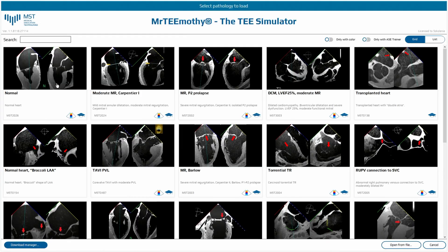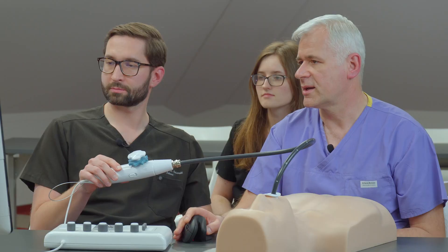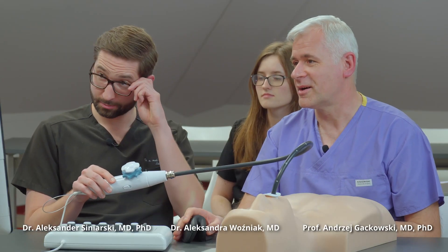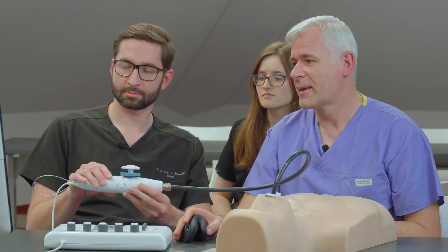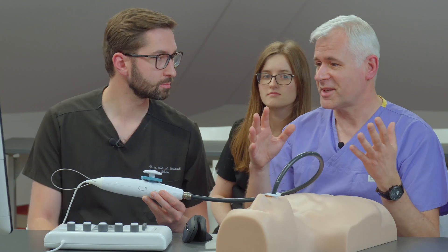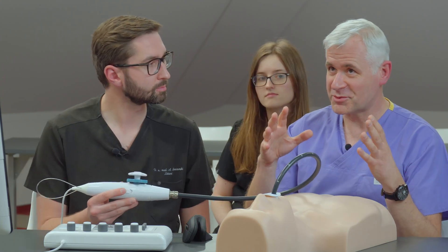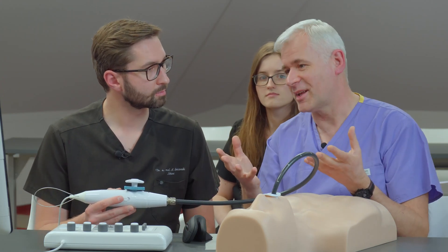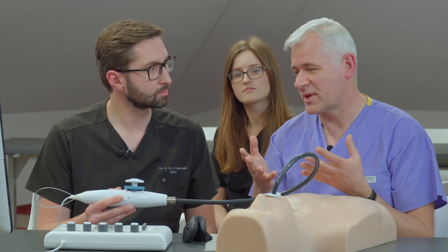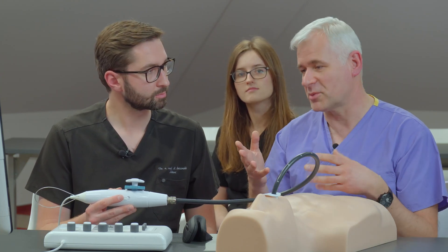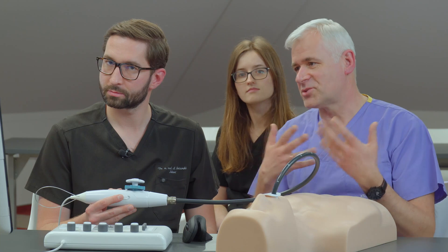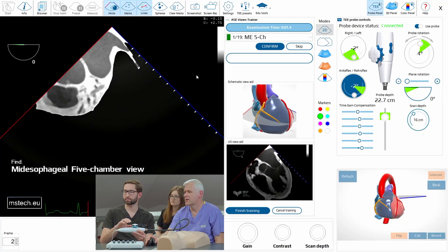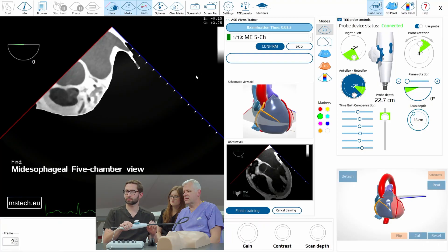Perhaps we'll come back to the first patient you examined and you will do this test, because you already know something about it. The order is different, but the thing is you will have to achieve an image that is provided by the machine, and that's why you will get really trained doing so. We can start now the test.